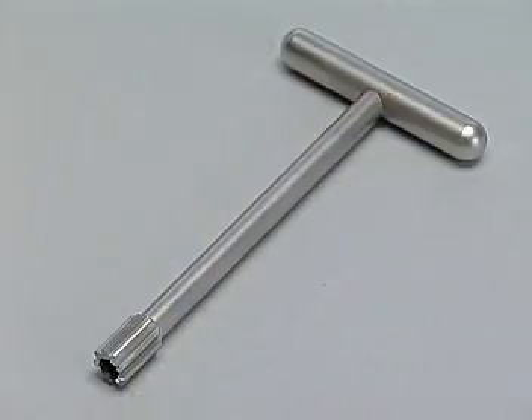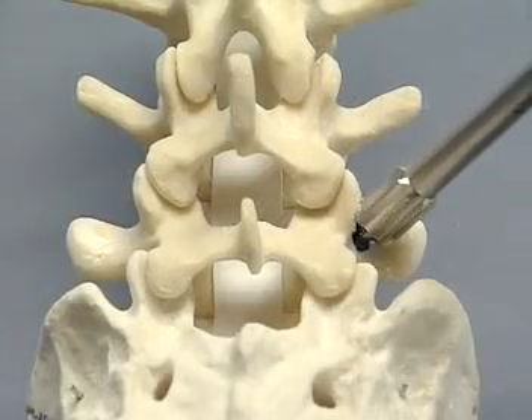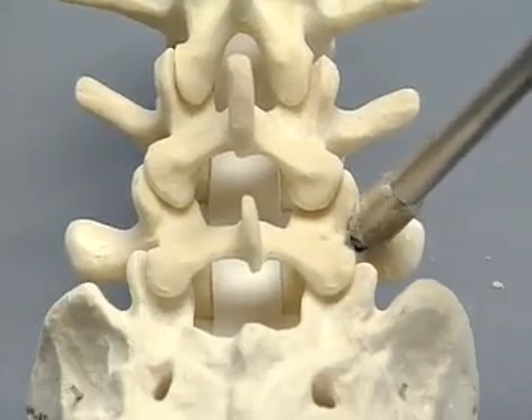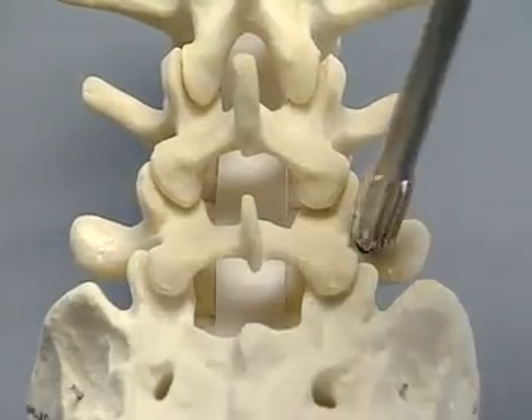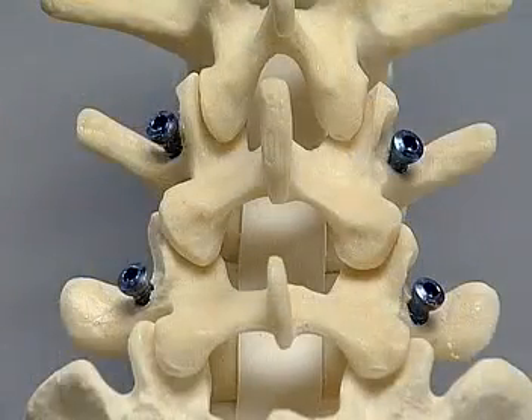The reamer for the Cliquex is now placed over the screw head and the bone is removed. The reamer is angled 25 degrees in all directions. This procedure ensures good clearance of bone to allow the Cliquex 3D head to be attached to the pedicle screw. The same procedure is undertaken in the other three pedicles.